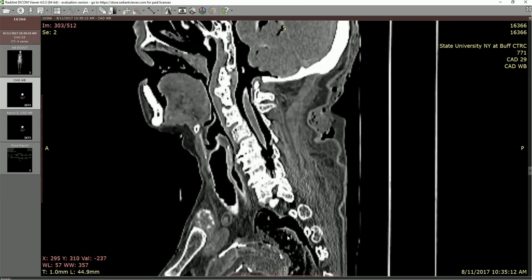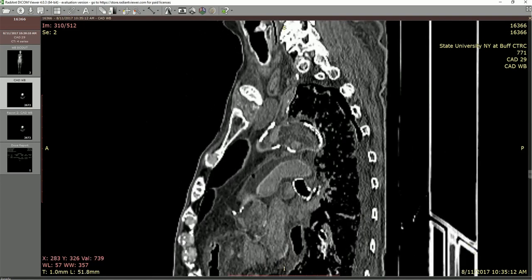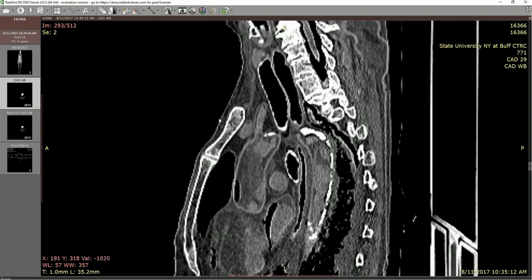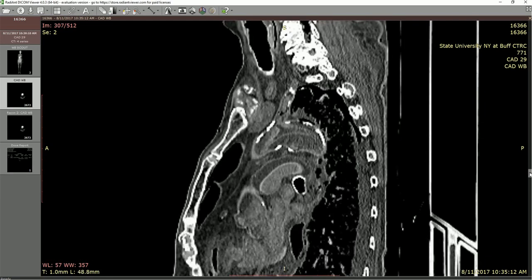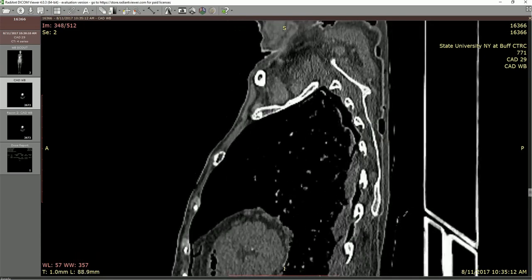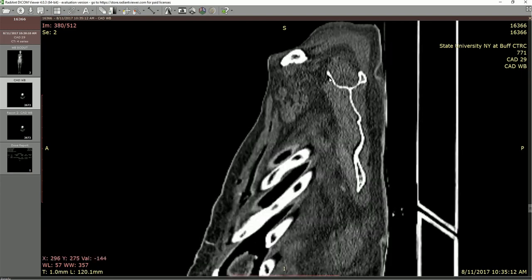Moving a little more out to the side, right around the mid-region you get a nice view of the sternum — there's the manubrium and the body. Going out to the side, we start to see the clavicle at the sternoclavicular joint. Nice view of the scapula: you can see the spine of the scapula about to become the acromion process, the supraspinous fossa containing the supraspinatus, the infraspinous fossa over here containing the infraspinatus muscle, which shows up quite nicely. Teres minor is going to be down here, and that's probably your teres major. Here's your subscapularis muscle fitting in the subscapular fossa.